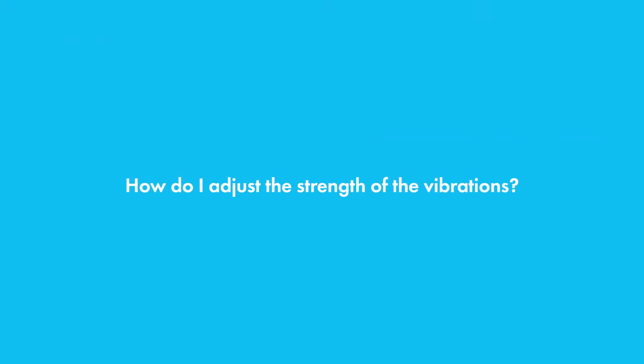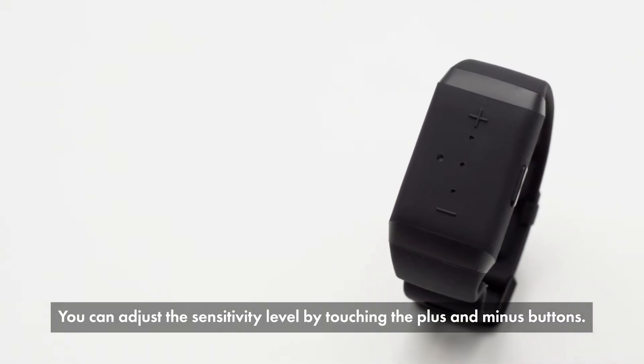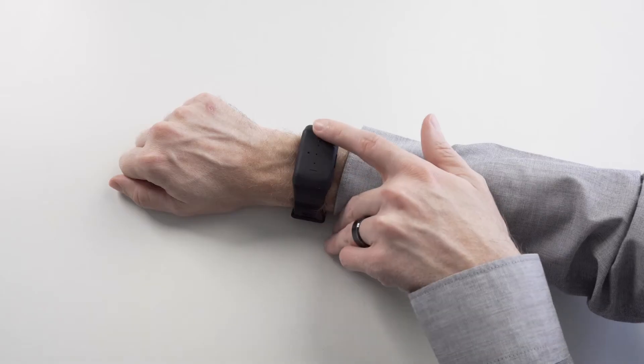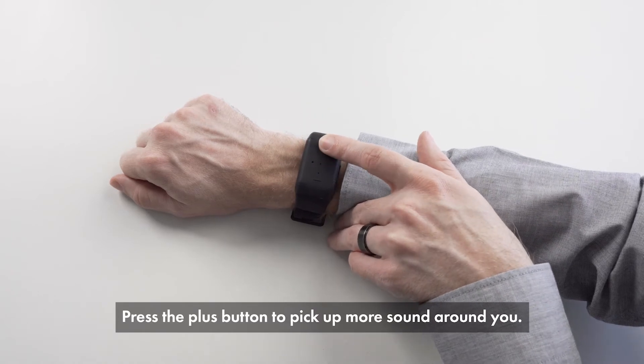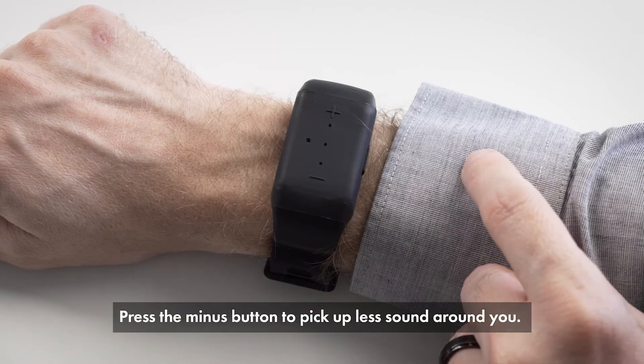How do I adjust the strength of the vibrations? You can adjust the sensitivity level by touching the plus and minus buttons. Press the plus button to pick up more sound around you, and press the minus button to pick up less sound around you.